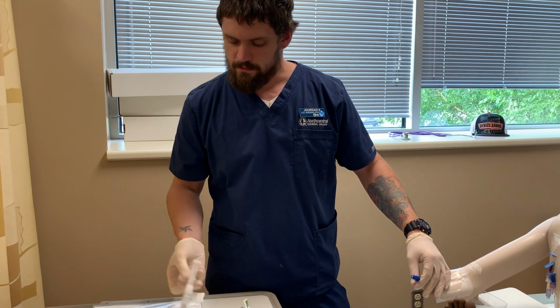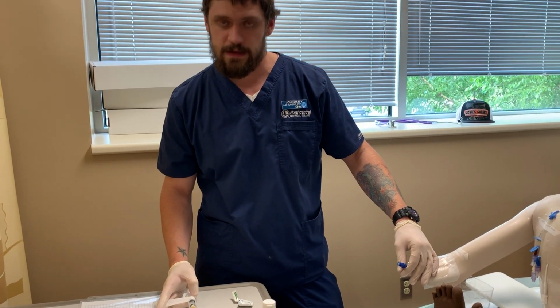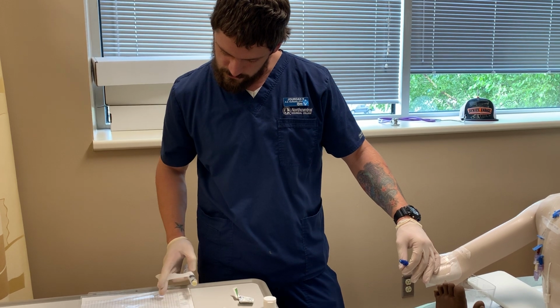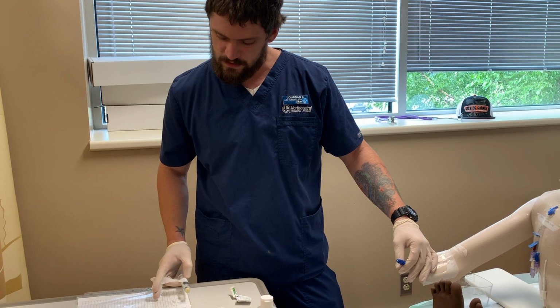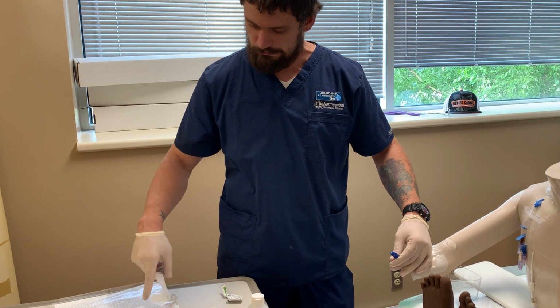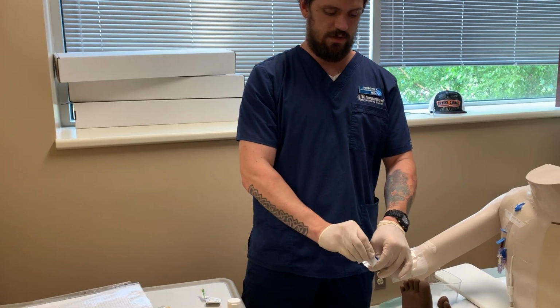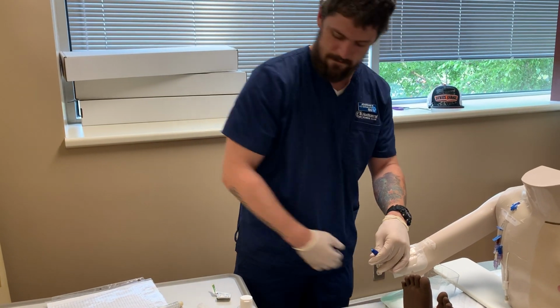Now, with our med, I am just going to get a full name and date of birth one more time from you, Miss Doe. Yeah, Jennifer Doe, 11/5/75. Awesome, and no allergies, right? No allergies. I am looking at the MAR, and our dose is correct. We have 7 milligrams here for IV push, diluted in 5 milliliters of normal saline, and I am good to give this med. If I can get the label off my hand. Okay, so again, we are going to wipe with alcohol for 20 to 30 seconds and allow that to dry.